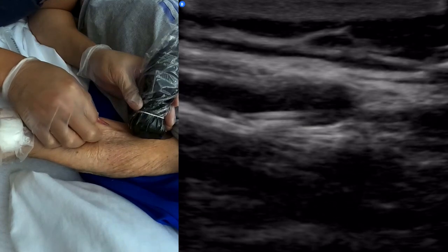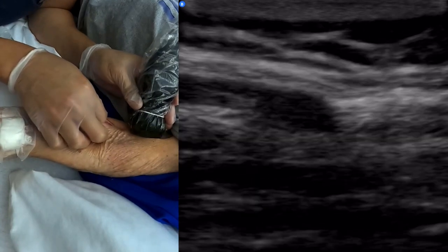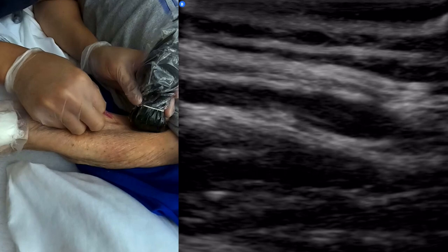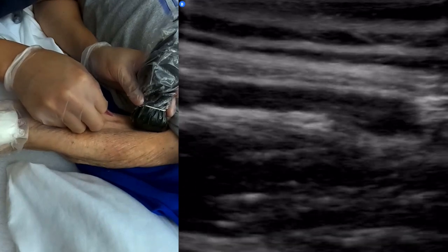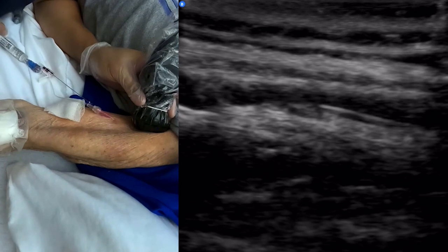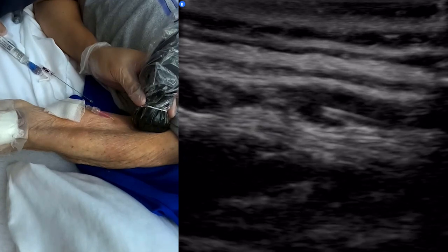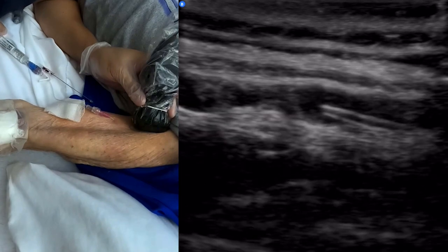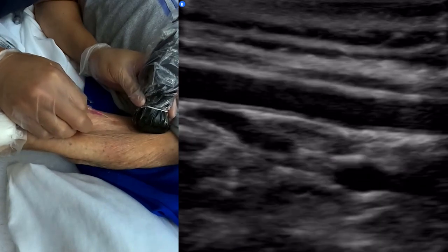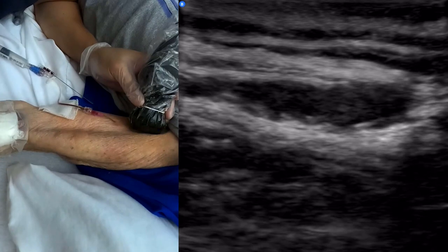I have a feeling it's going through the tissue here. Please tell me it's not. See that deviation there? That's my flush. That's where the tip of my catheter is. Seems to be getting stuck there. Stuck there. So I'm gonna pull back right here. This seems to be where it's resting well. I get nice good flush, nice good return. So I'm not gonna mess with that.